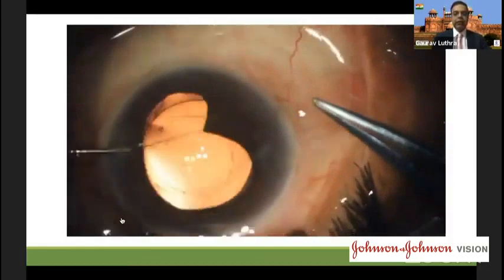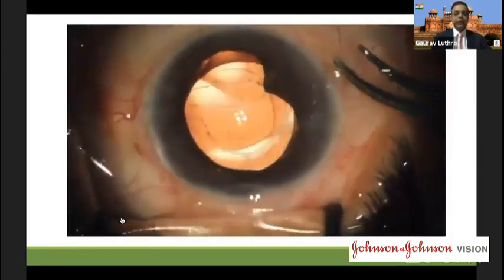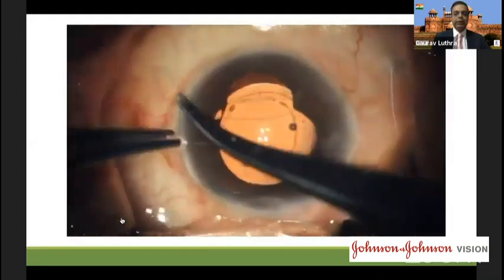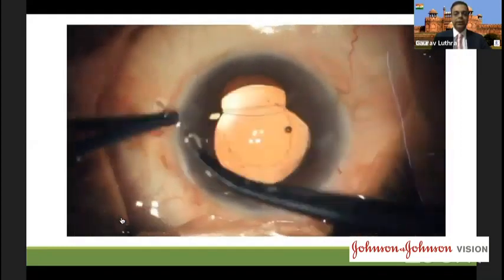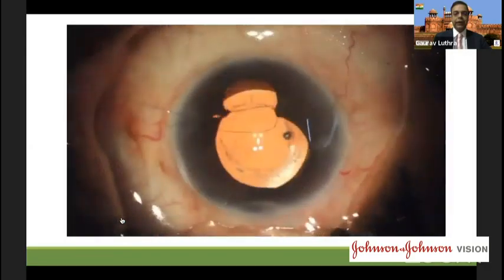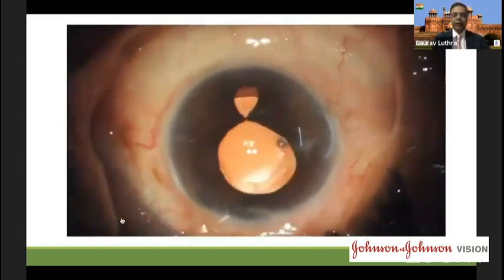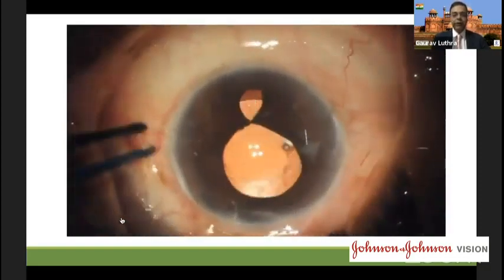We have the loop out now, and once that loop is out from the paracentesis, you pass a single pass through with four throws. Essentially, you're passing this four times through that loop in the same direction. And then you just pull on it. It's a slip knot. It goes nicely. Now you'll be wondering why I've left behind that opening there. So we will be coming back to tackle it.